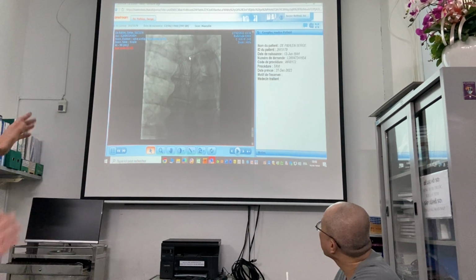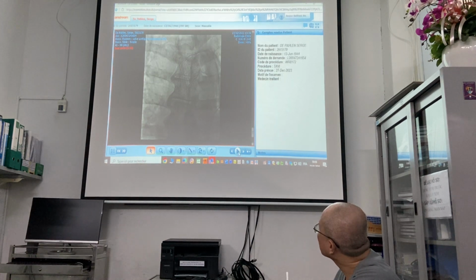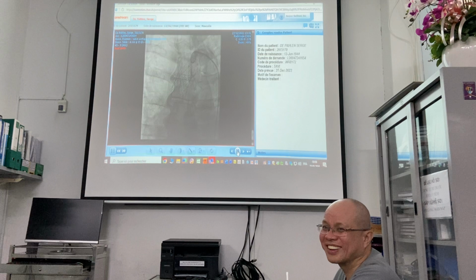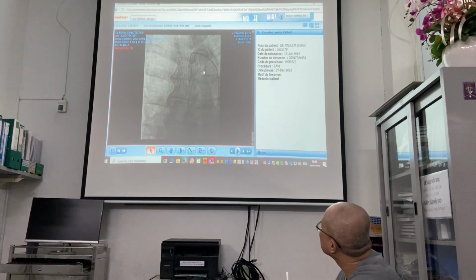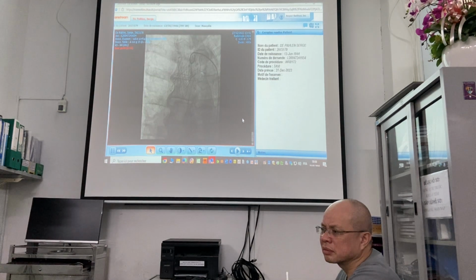Okay. So I flared it, and then it's not finished yet. Now the valve, the distal part, is much more open, but then I cannot release my snare because it's stuck around this valve. There's one more complication. But I was lucky, I just shook a little bit and then at a certain moment it becomes free. You see it's stuck here. And then I can take it. Yeah, it will be there forever. Yes, forever. And you see the angio. So now the valve is more open, behind the truncus. This is the 27th of December, so 1 month ago, and the patient is fine.